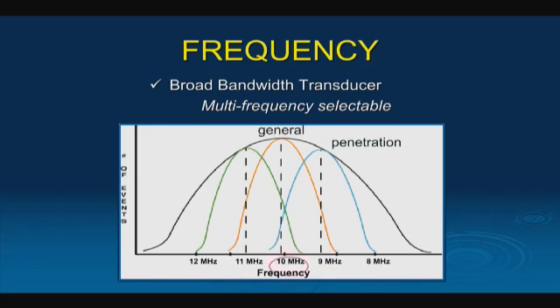Most systems, when you tell it what kind of exam you're going to do, will default at the center frequency, which is assuming that you have an average size patient, okay?